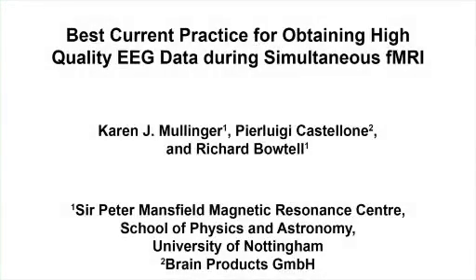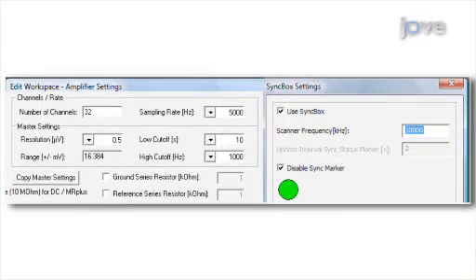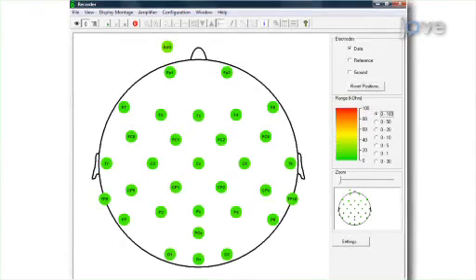The overall goal of this procedure is to set up MR-compatible EEG equipment inside an MRI scanner for simultaneous acquisition of high-quality EEG and fMRI data. This is accomplished by first correctly setting up the EEG filters, sampling rate and synchronization. The next step is to ensure that there are good connections between the EEG electrodes and the subject's scalp.